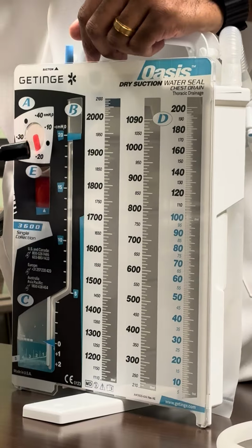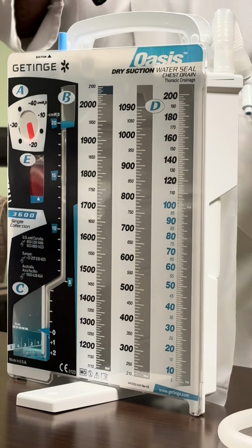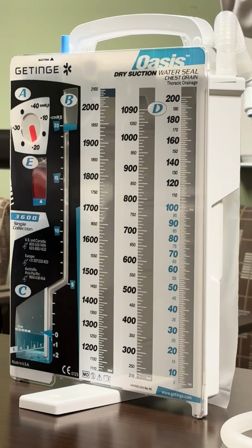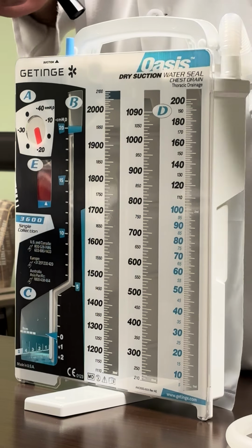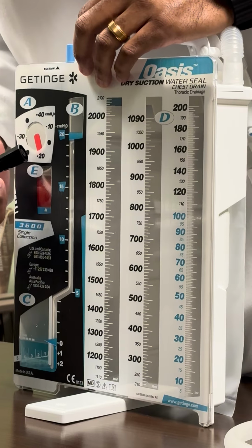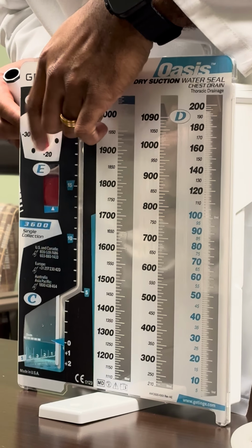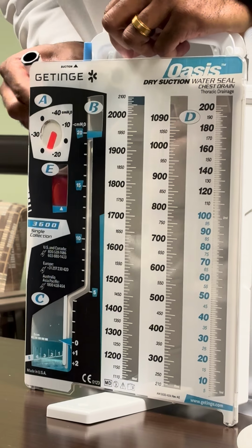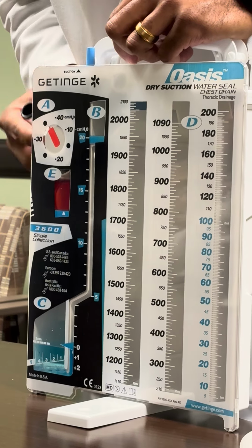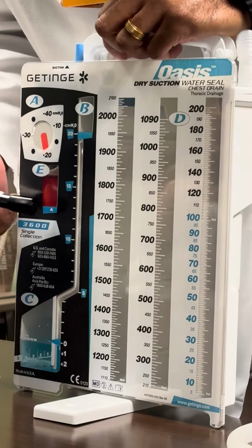But the other thing to keep in mind here is what we place our settings on. So we have attached the patient to wall suction at negative 80 to 100 centimeters. And by the way, you place the suction right here. And so what you should see, by default, this is set at negative 20 centimeters of water. You can increase that to negative 30 or negative 40. That's a conversation with the provider. Usually the provider handles this part, but usually by default, it's at negative 20.